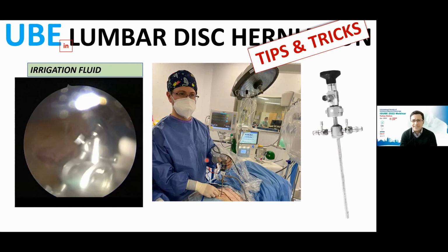Again, about the fluid, the tip is that the pressure is not important. What is most important is the outflow of the fluid. If you see, my bag is at my head height, I'm at 1 meter or not much higher than that. But look at this, look at my hand. This is most important. I try to open my working portal because all the fluid goes out and I can see very, very well.